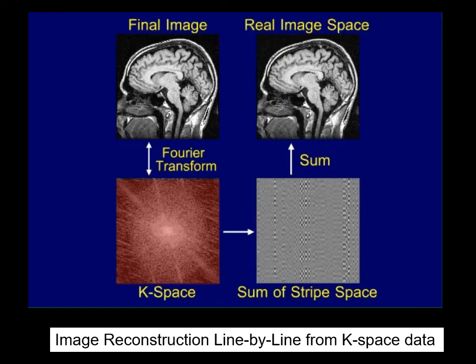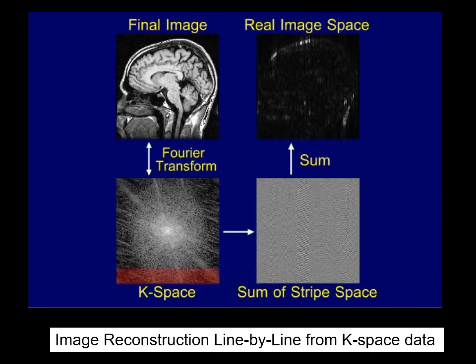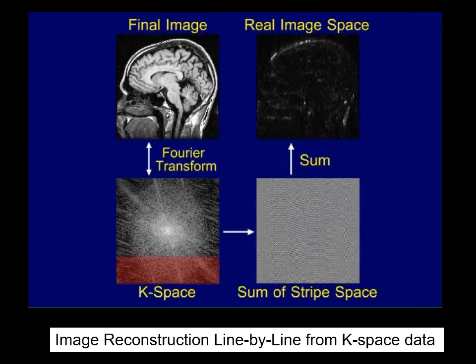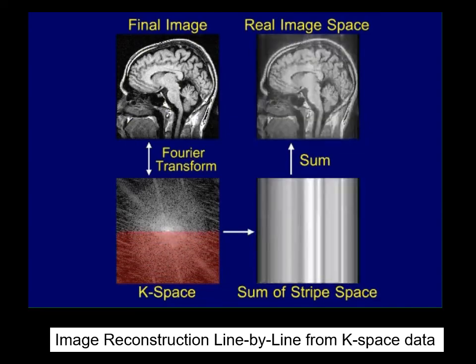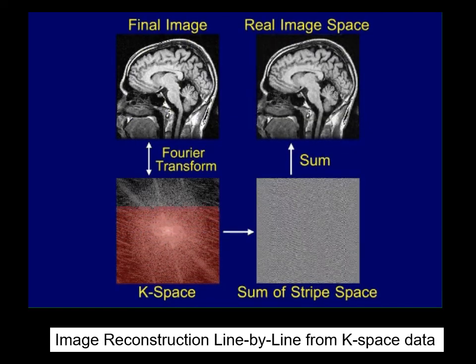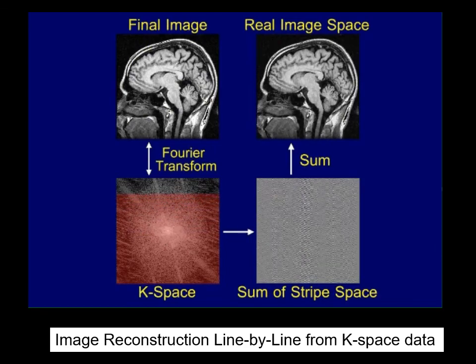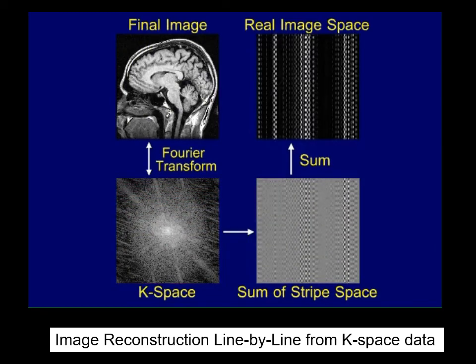Let's watch this one more time as we cross the middle of K-space. Bottom quarter, bottom 40%, cross the center, lots of signal, almost have the complete image, gets better and better signal and noise and edge information, but the image contrast does not change very much.